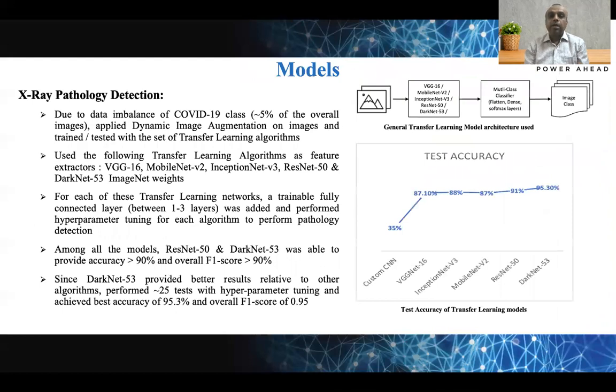Finally, we apply the model selection. In this process, we are taking these pre-processed images and passing them through the transfer learning nets one at a time, adding a few fully connected layers, training them, and eventually testing them against the standard test data.